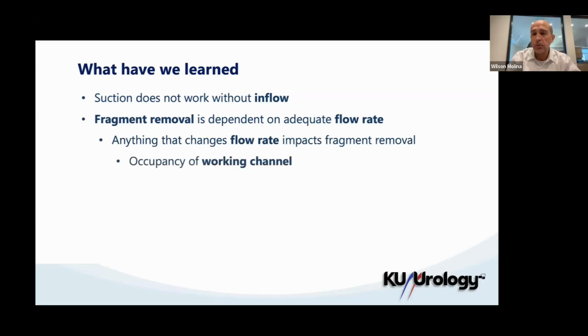So if you think about occupancy of the working channel, if you have a laser fiber inside the working channel, think about removing it if you feel there is no retrieval of the stones when you're doing active retrieval. The inflow must be continuous. So if you're using any type of handheld device like a single action pump, it doesn't really work when you're using an access sheath with suction. So you've got to use a continuous flow. And Steph is going to talk about the ZSR system, but the inflow must be continuous, it cannot be intermittent. And there is really a balance between inflow and outflow that makes the magic happen.